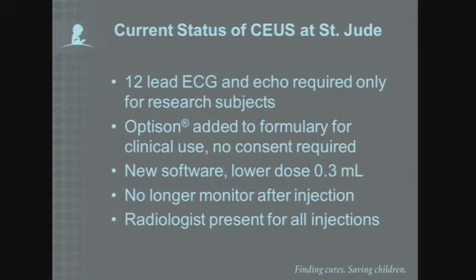We no longer monitor any of our patients, our research patients, or our clinical patients after performing our injections. We do continue to have a radiologist present in the room for all injections, but this isn't really for safety reasons. This is more just as a quality assurance to ensure that injections are performed correctly and cine clips are recorded correctly.